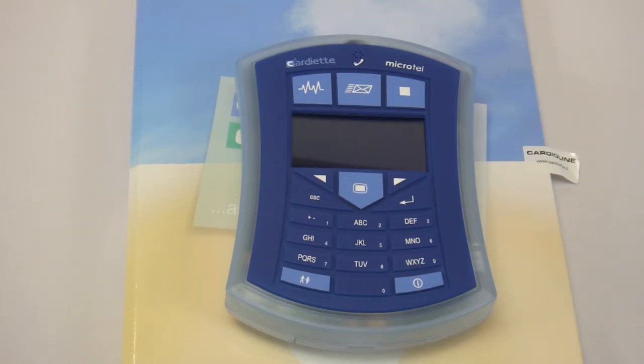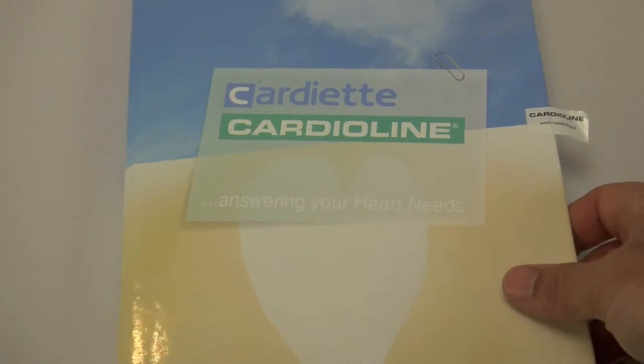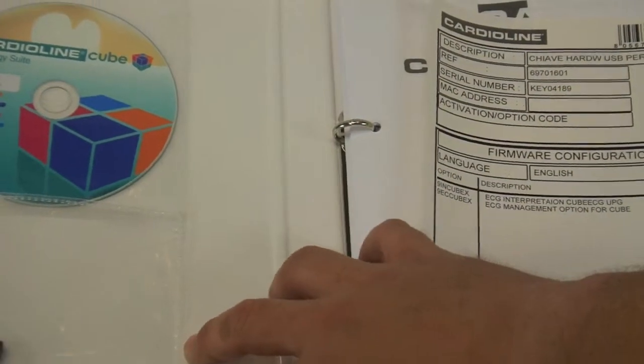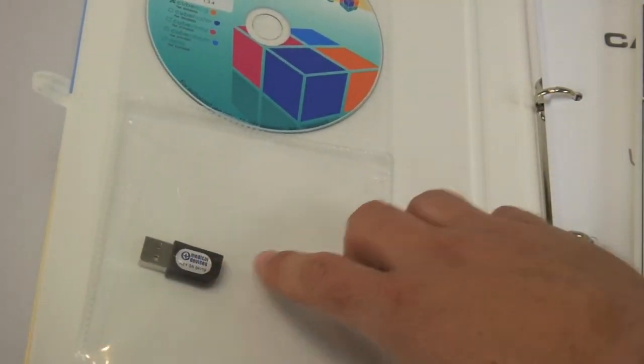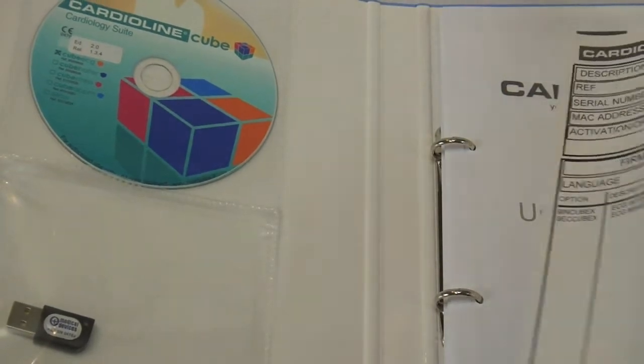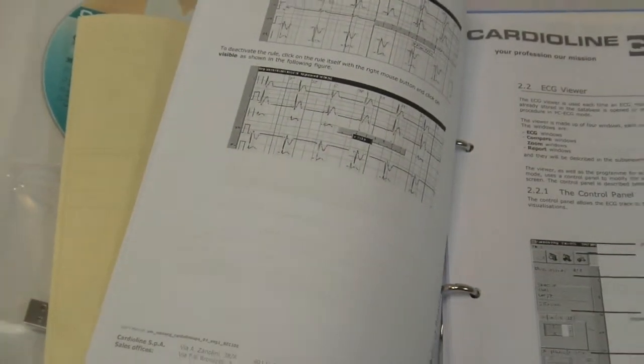I will go over a full overview of the CardioLine Cube software in another video in our series entitled Introduction to CardioLine Cube, but I'll just show you that the Cube software does come with the unit along with a security key and a full user manual on how to use the Cube software suite.